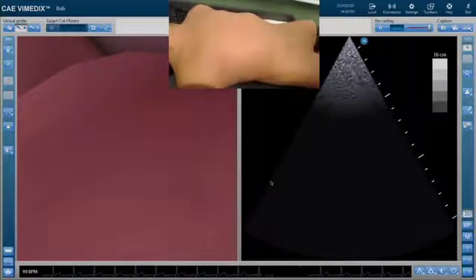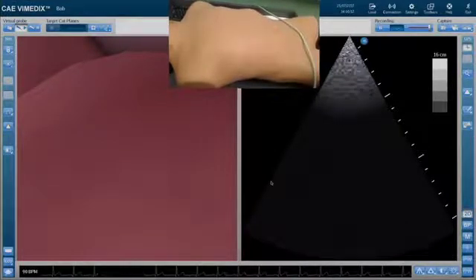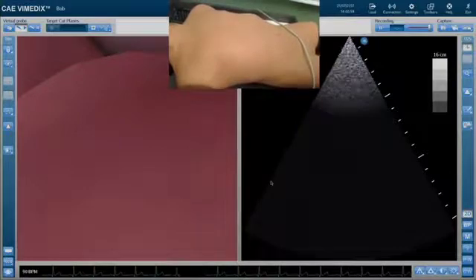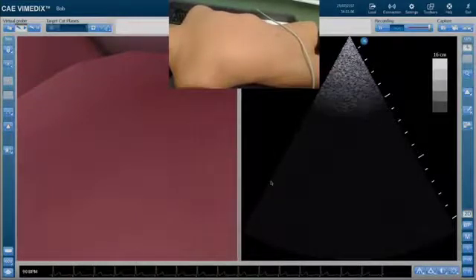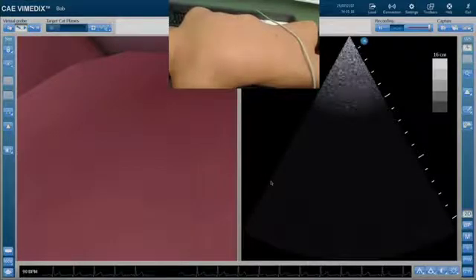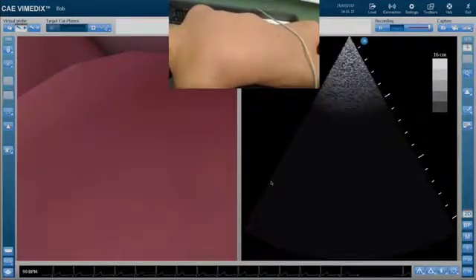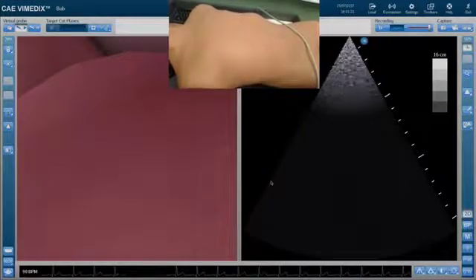The key thing to remember about the subxiphoid window is that because we are insonating a little bit further, the picture quality will be a little bit poorer compared to the parasternal and apical windows. But you'll find as we do the examination that often this window can be ideal in situations where we're not able to get to the chest, or the patient's position prevents optimization of those parasternal or apical windows. The subxiphoid window, in fact, is much less patient position dependent. The supine position can give you an excellent window into the heart.